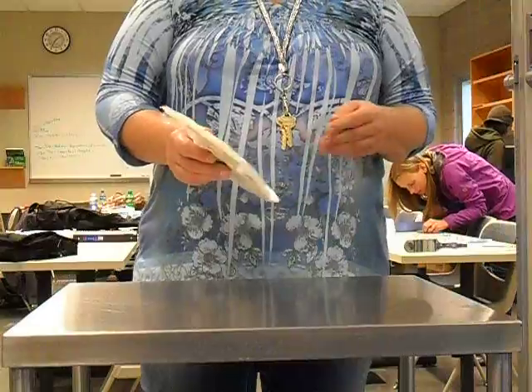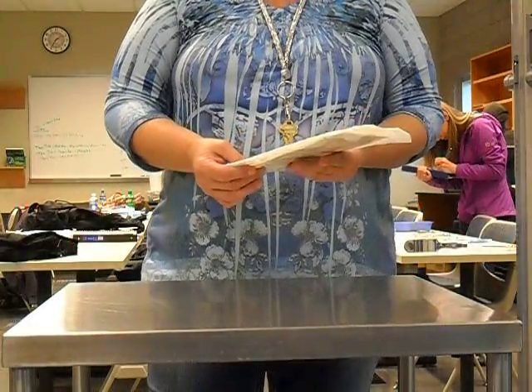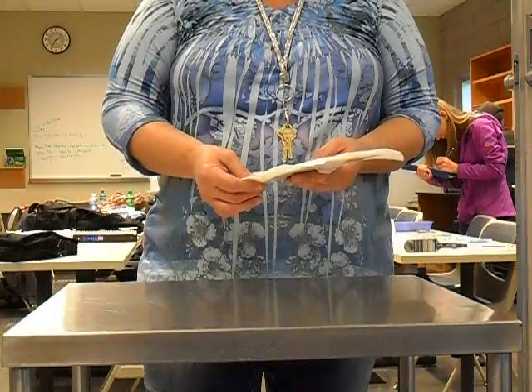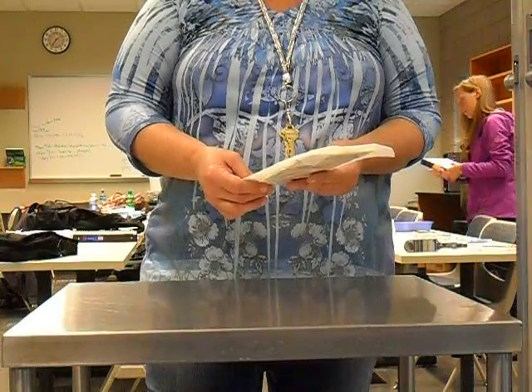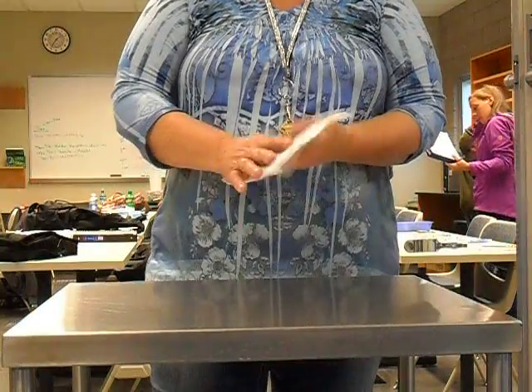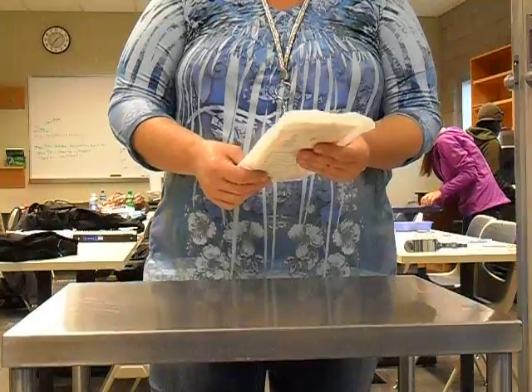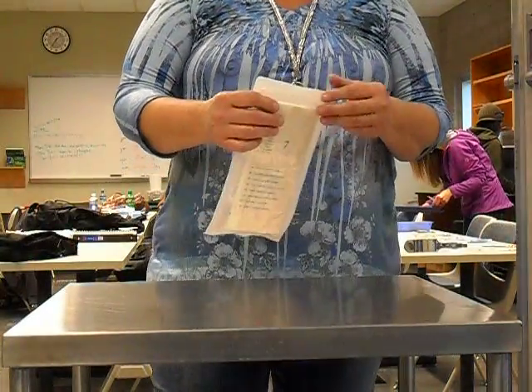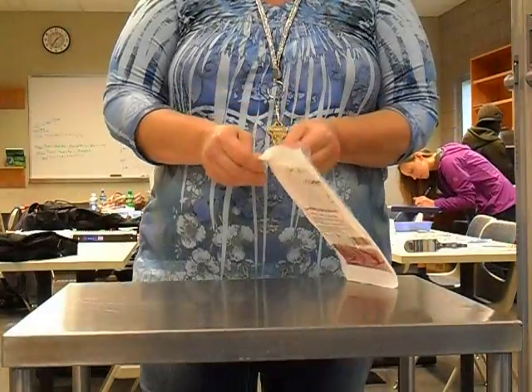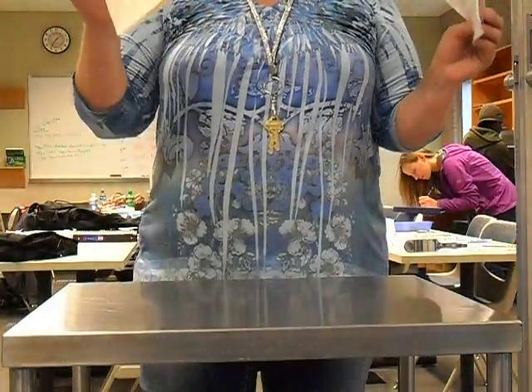What it does have to be, though, is dry. No dirt, grease, dry. So you're going to check your gloves for everything that we check whenever we are going to open a sterile supply. We're going to look to see if it has expired or not. So we're looking for expiration date. We're feeling it to make sure that there is no water or moisture. We don't want any tears in the package, and we don't want any dirt or grease. And so knowing that now, we can open up the package, and we can take the gloves out.